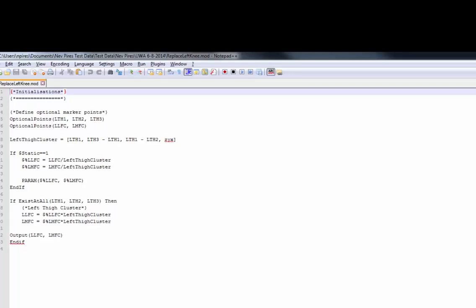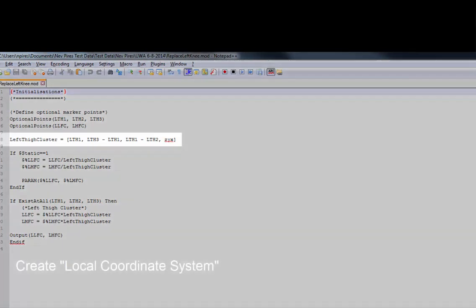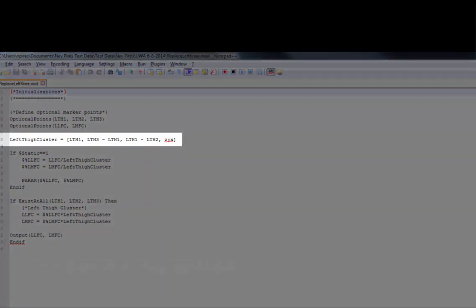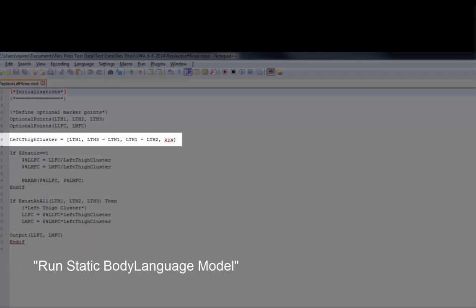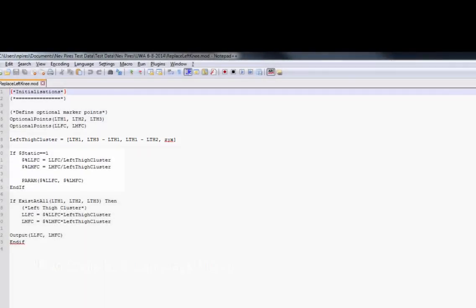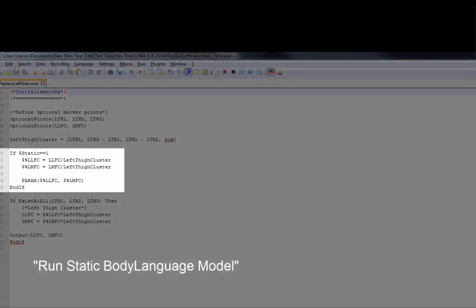If there is a gap, the script will fail, but defining the optional points will prevent this from occurring. Then I'm going to create a local coordinate system for the left thigh cluster. Everything run in this if statement is run in the static body language model part of the pipeline.